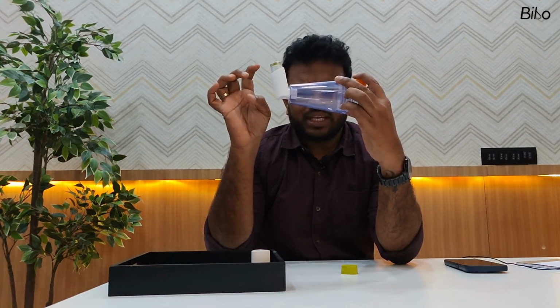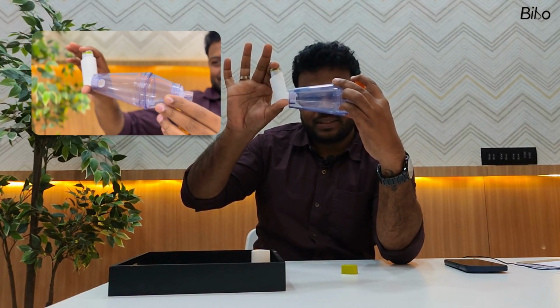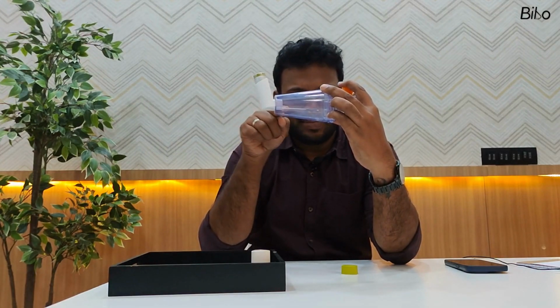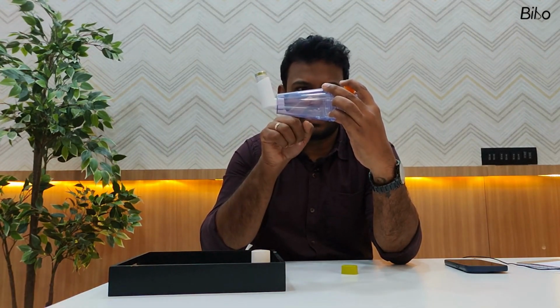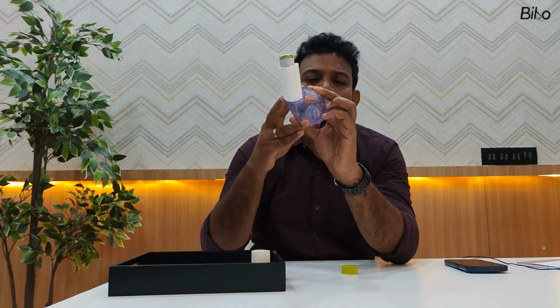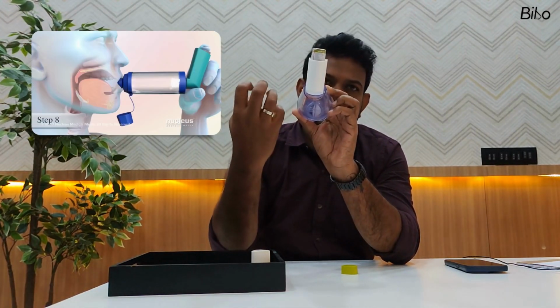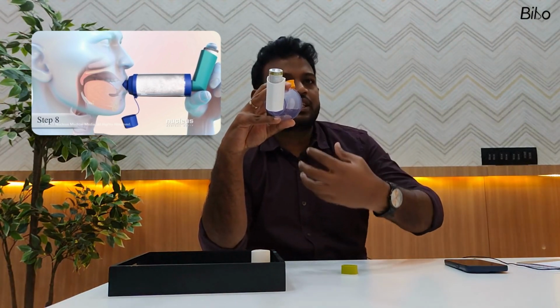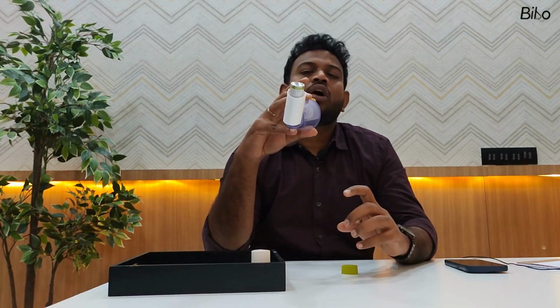Then, if you are able to see, the moment I press the canister, I don't know how many of you can see this, but there is a mist coming into the spacer. So what it is going to do is keep that mist in a suspended form, which is available for the patient to inhale through the mouth. So how are we going to do it?